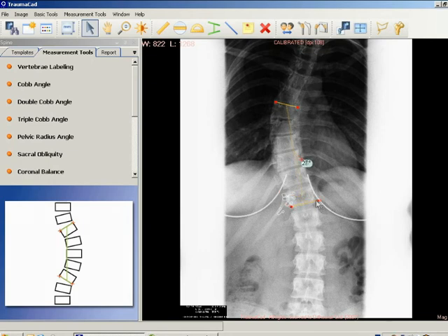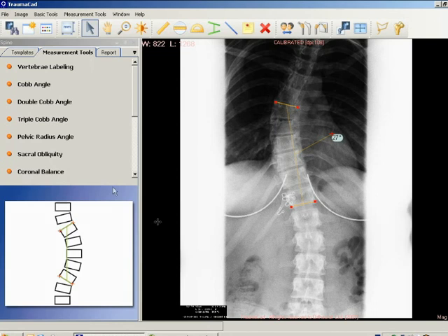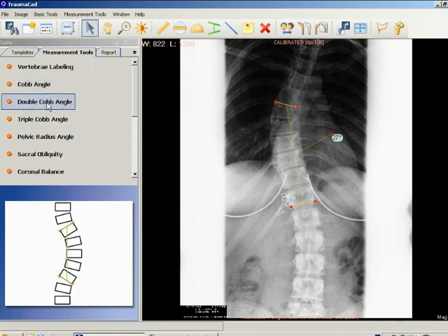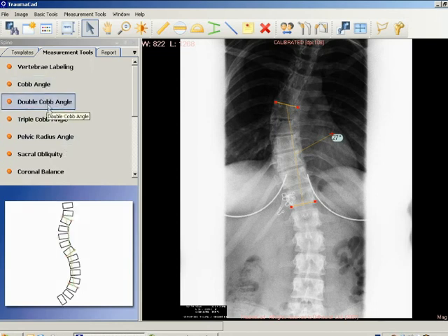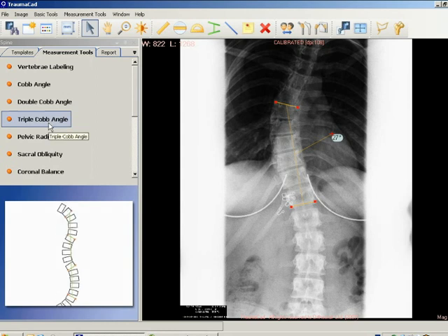In S-shaped scoliosis where there are two contiguous curves, the lower end vertebra of the upper curve represents the upper end vertebra of the lower curve. In some cases there may be a third contiguous curve.